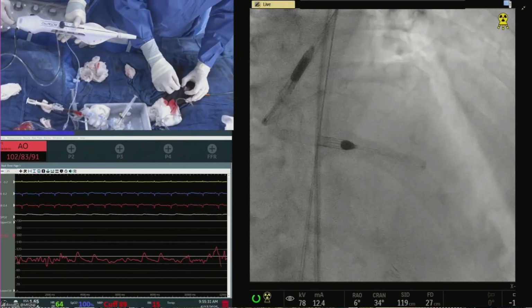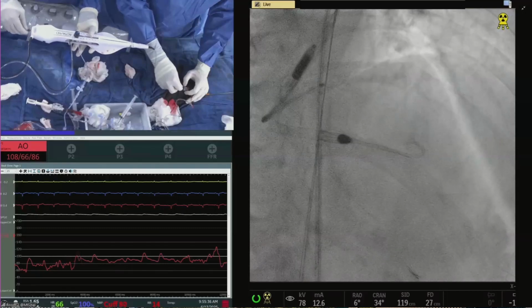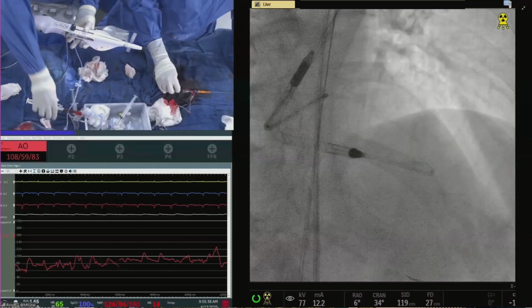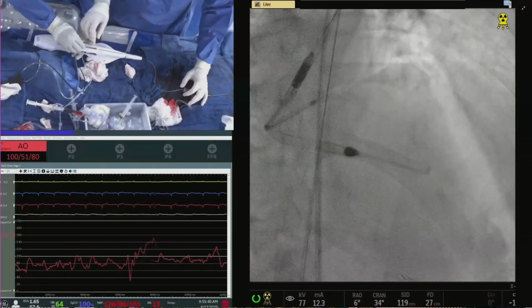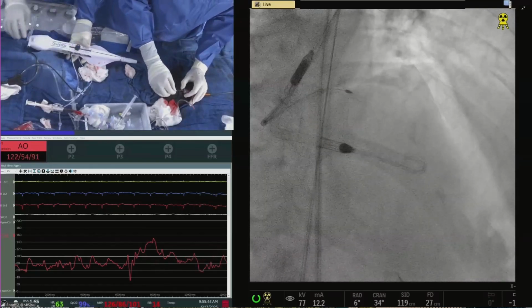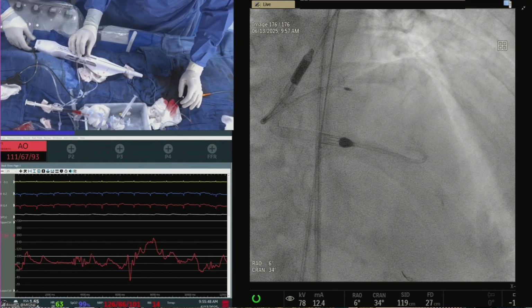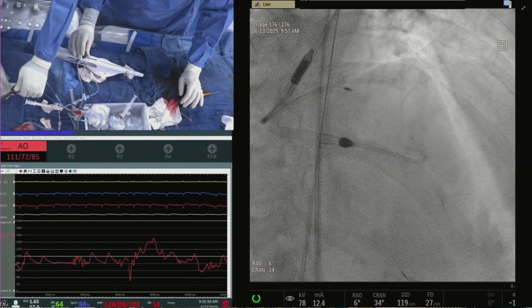So the thing is, people will now tell me why you're doing rotational atherectomy, do imaging, maybe do IVL. No, but since the balloon is not crossing anything, nothing is crossing, so there's nothing you can do. Good. Okay, that's it. It's the same burr, 1.25. I know you were discussing imaging, but let us try to do this here.